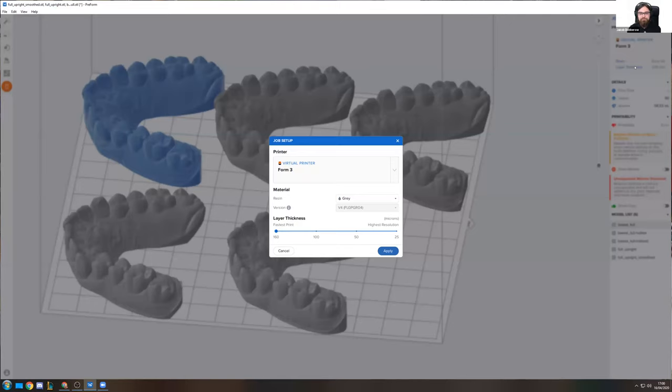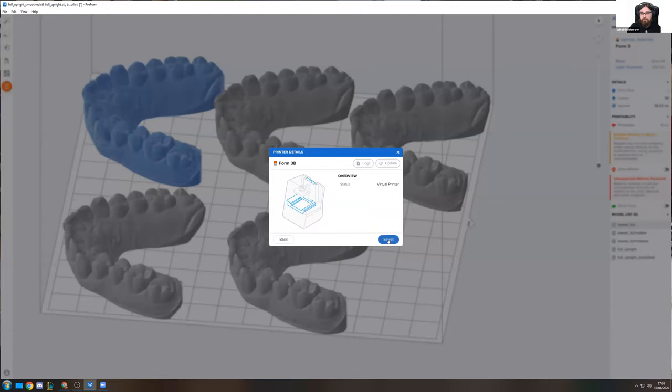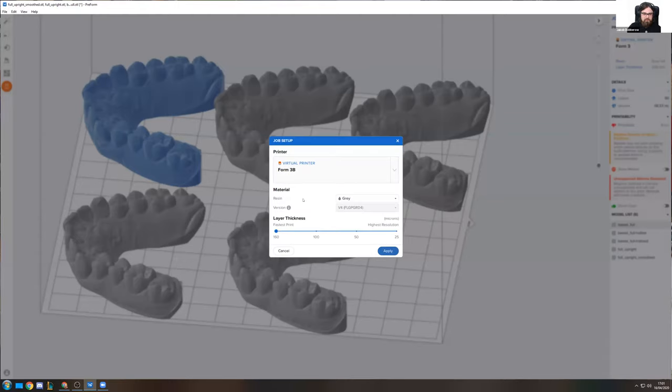So first things first, we always are greeted with this job setup page where we are selecting the material that we want to use. As you can see, there's quite a list here. I'm just going to be using the gray resin. As I said, most of our customers are actually using this. And then you can also select the printer that you want to use for your print setup. I'm using the Form 3B here because that's also what I have sitting right next to me.